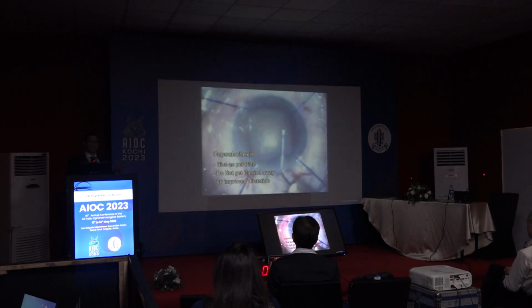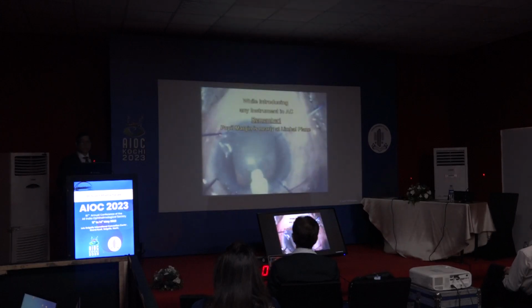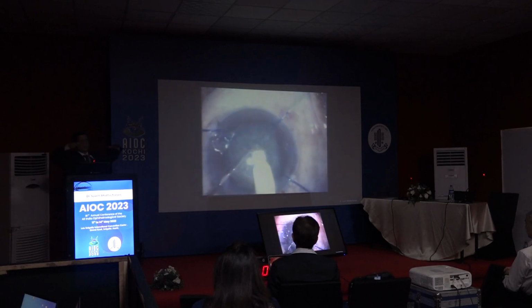So I place my phaco incision generally after. When I do very little iris hooks now. I'm sorry, that's why the video quality is from a VHS one. So while introducing any instrument, remember the pupil margin has now been elevated to the limbus margin.